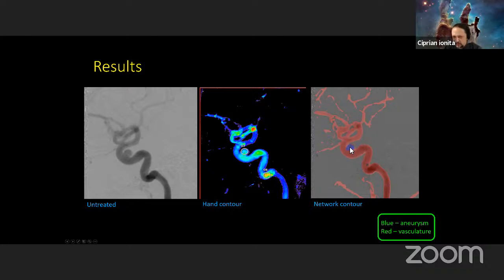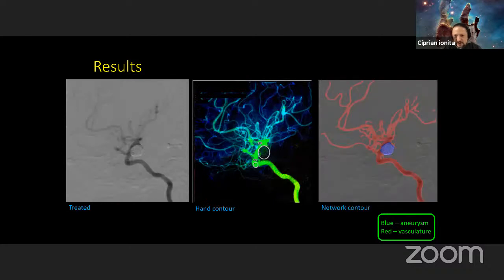So I will focus only on the aneurysms. And you see here how the AI has done a pretty good job at the aneurysm, but the distal part onto the arteries, it's so-so. So in general, there is good agreement. And if we use coils, again, there is no problem. Very good agreement between what a user will do and what the AI will segment.